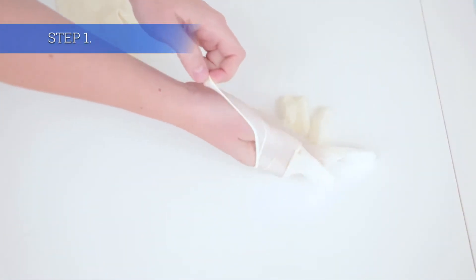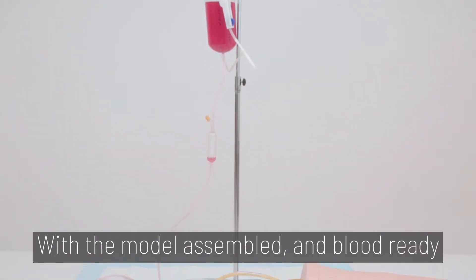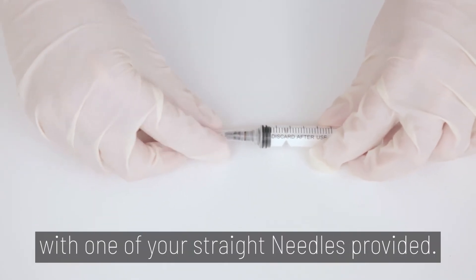Let's dive in! Step 1. Make sure to always wear gloves for the blood draw. With the model assembled and blood ready, prep your syringe by connecting your syringe with one of the straight needles provided.